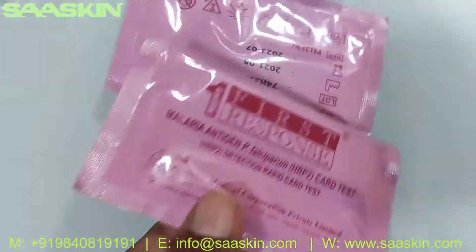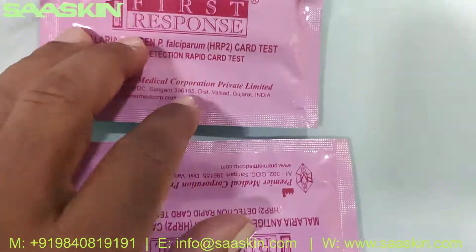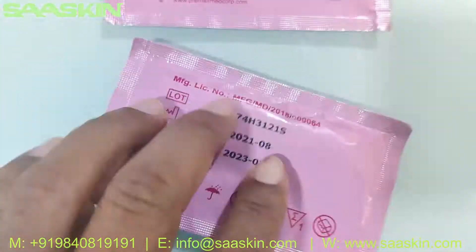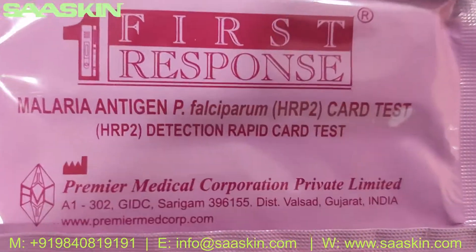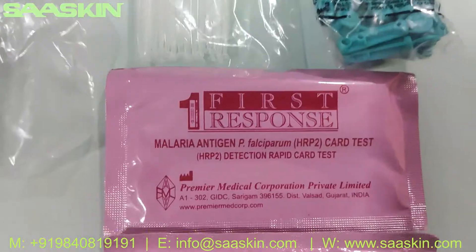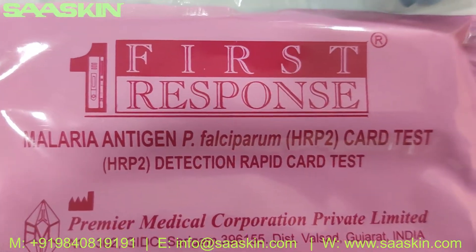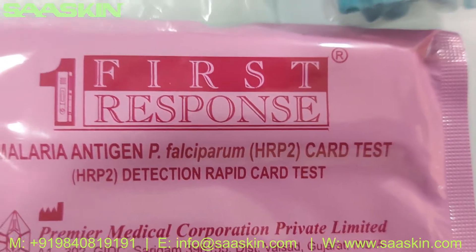Here you go, you can see the 25 test cassettes — I'll put two samples here so you can see. The key point here is that this is a WHO pre-qualified product: First Response Malaria Antigen PF Rapid Card Test.